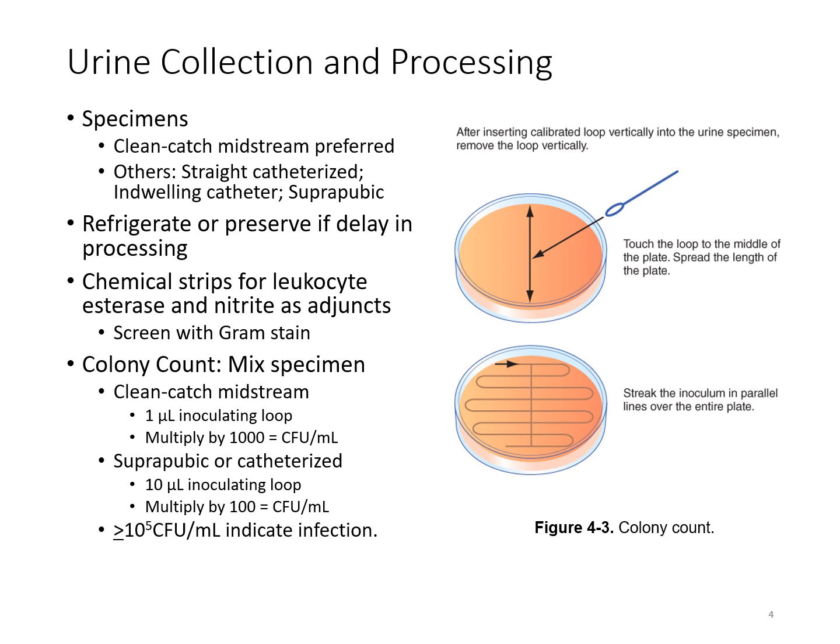Of course, if the sample cannot be processed right away, then you would need to refrigerate it or use some sort of preservative. This is where a lot of physicians' offices will use those little yellow tubes, which they use to siphon up a little bit of the urine, and it goes into a tube that has a preservative in it to keep any bacteria in there from multiplying and giving false results.